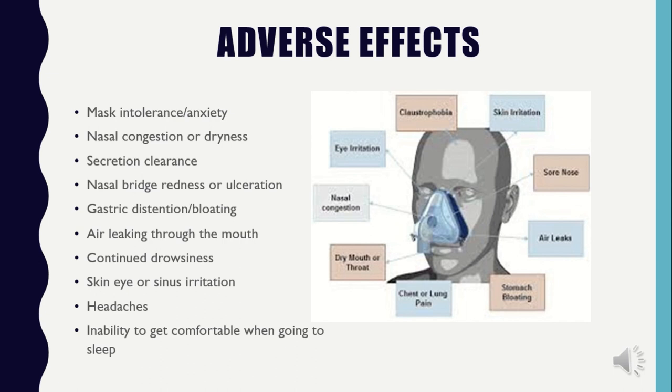Gastric distension or bloating, air leaking through the mouth, continued drowsiness, skin, eye, or sinus irritation, headaches, and inability to get comfortable when going to sleep.